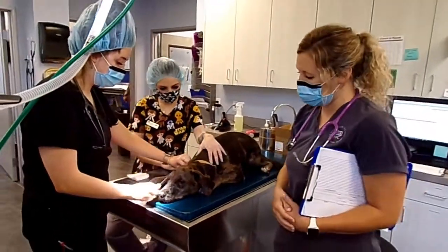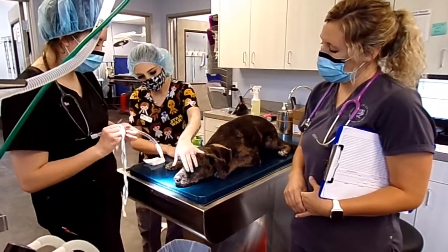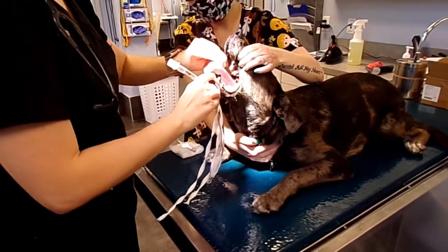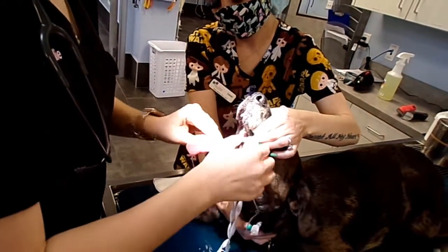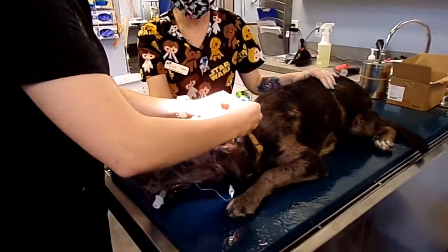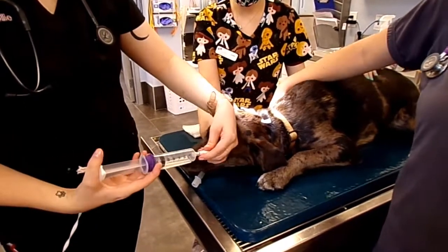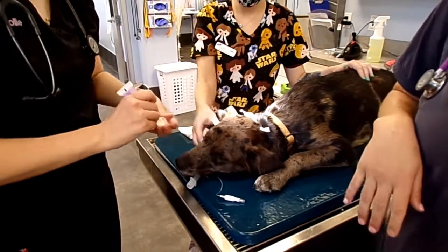The propofol has been administered. Holly is checking to make sure the tube is the right size for Harlow. Cassie holds up her head so Holly can visualize down her throat, finds the arytenoid cartilages, and places the tube right in there. Then we do our tie and inflate the cuff.